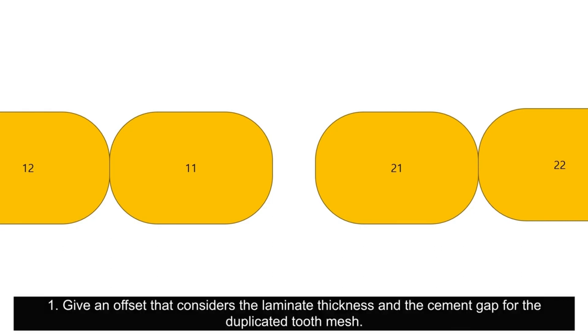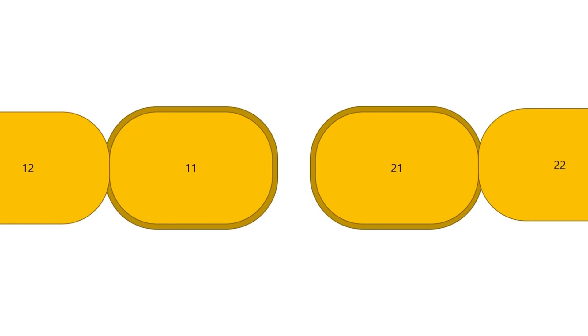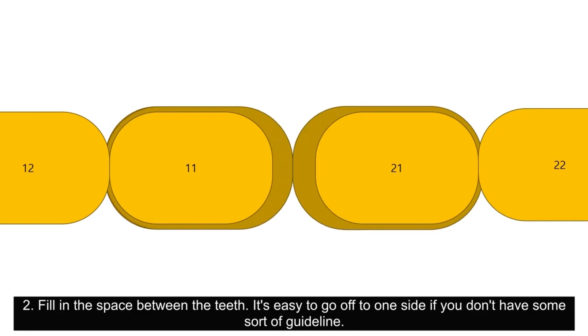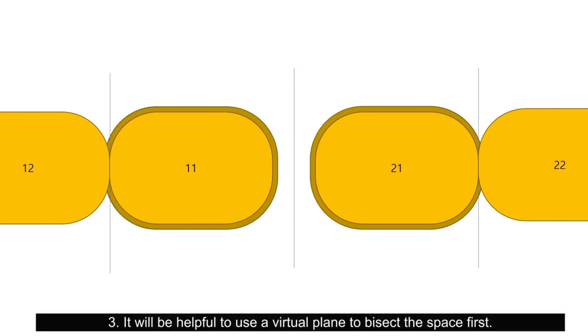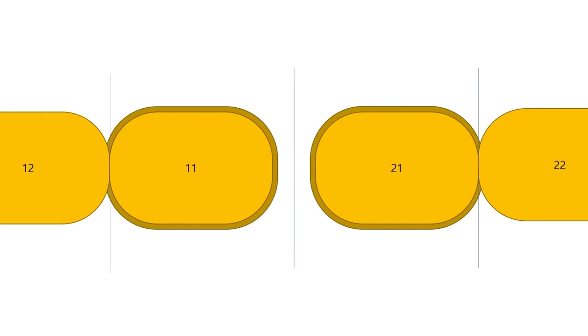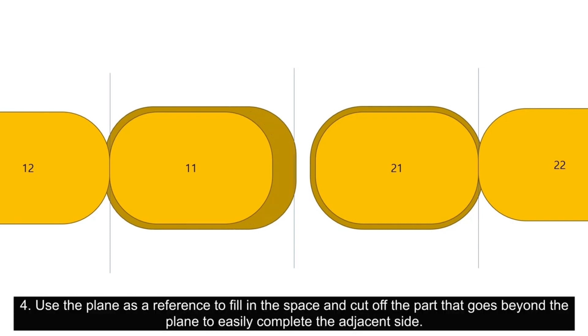Give an offset that considers the laminate thickness and the cement gap for the duplicated tooth mesh. Fill in the space between the teeth. It is easy to go off to one side if you don't have some sort of guideline. It will be helpful to use a virtual plane to bisect the space first. Use the plane as a reference to fill in the space and cut off the part that goes beyond the plane to easily complete the adjacent side.